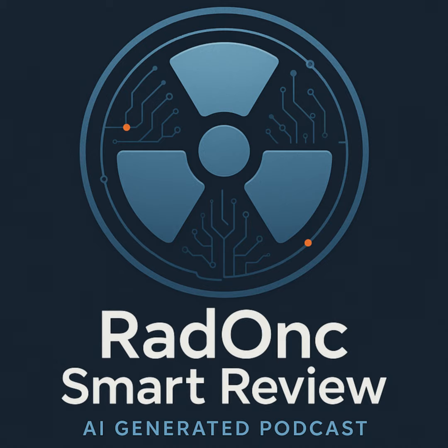Makes sense. Why is having this standard DICOM and these RT objects so incredibly critical for you listening, practicing radiation oncology? It all comes down to patient safety and treatment accuracy, especially in today's world with equipment from so many different manufacturers. Interoperability. That's the key word, interoperability. DICOM ensures that the CT scanner from Company A sends images that the planning system from Company B can understand. Which generates an RT plan. That the LINAC from Company C can read and deliver accurately, all while the patient's info is tracked in the record and verify system from Company D.